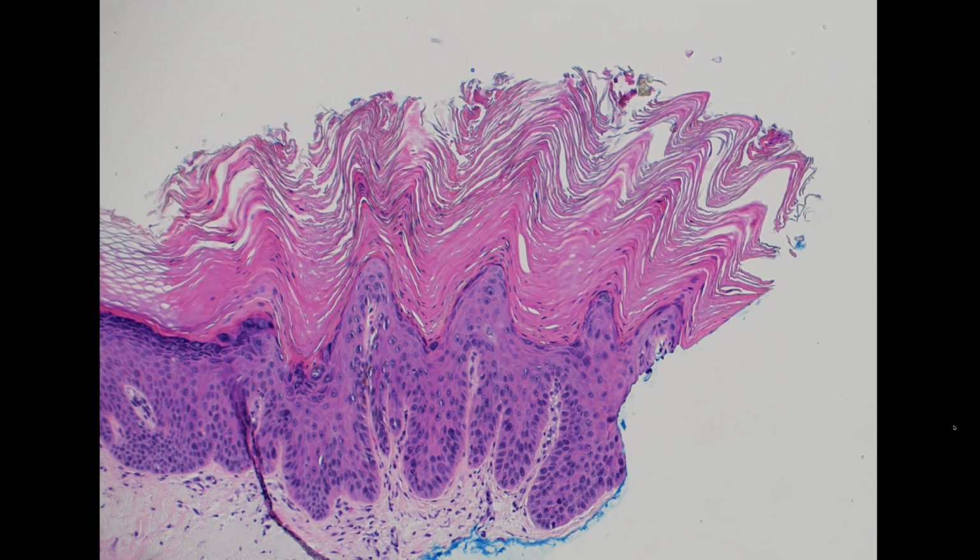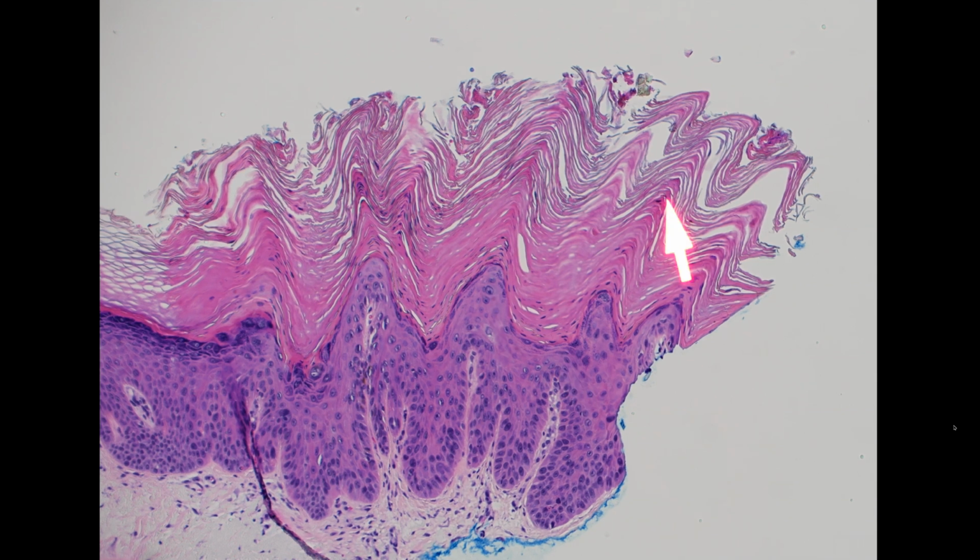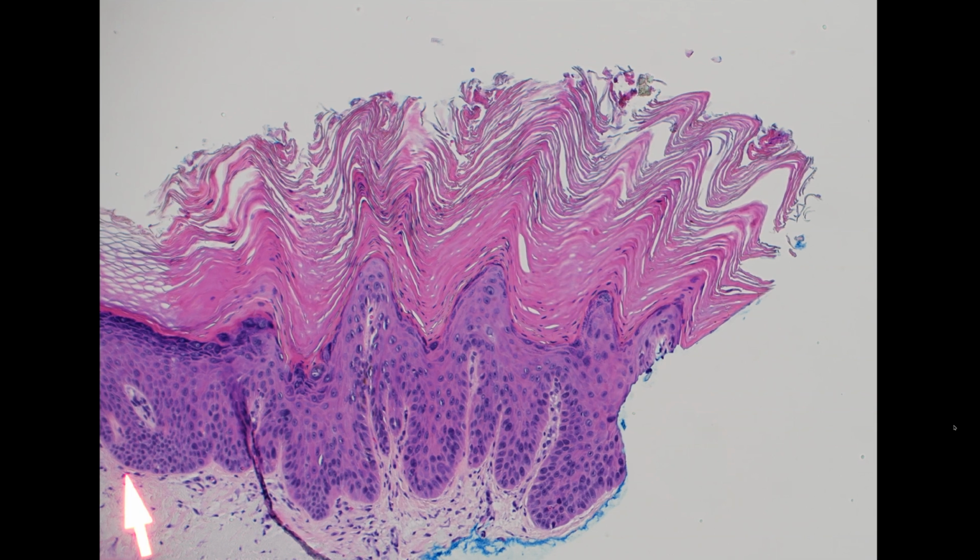It's undulating and papillomatous, and every once in a while actinic keratoses get kind of a warty look on the surface of them. And in this case, it's even got little spires of parakeratosis with orthokeratin, meaning keratin without the retained keratinocyte nuclei in between. So that's the way a wart would grow, but I think with the jumbled atypia here, actinic keratosis is a better name than verruca or warts. So sometimes you can see lesions that have overlap between the two that look like a wart, but have also some AK, actinic keratosis, inside them.